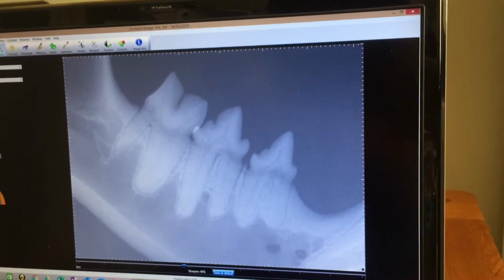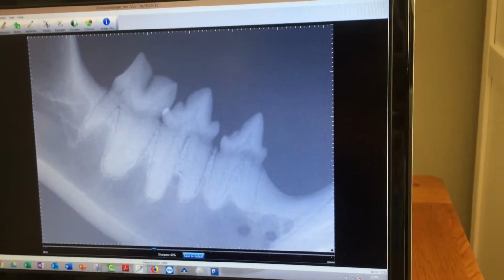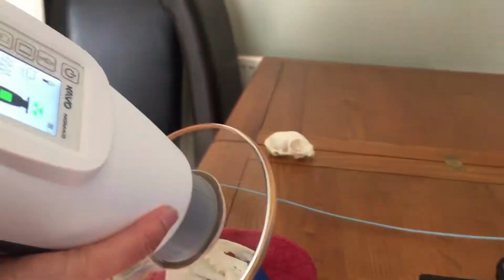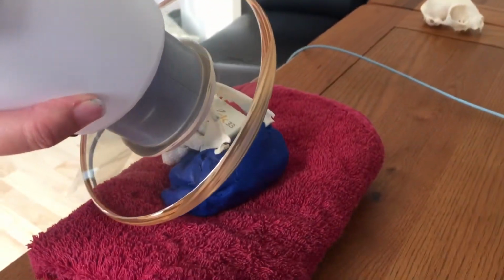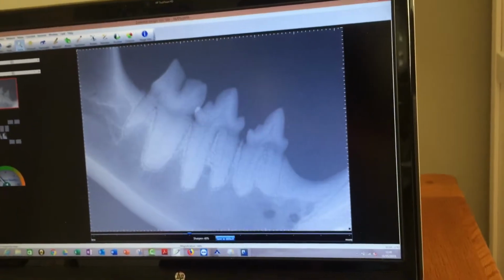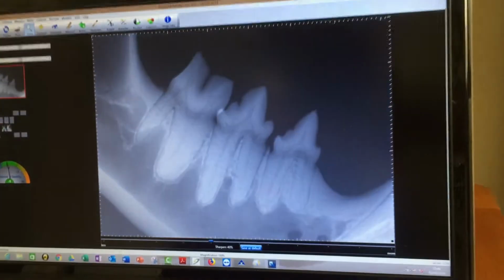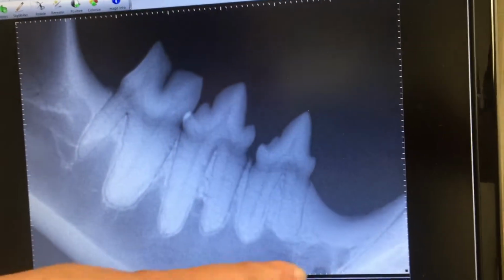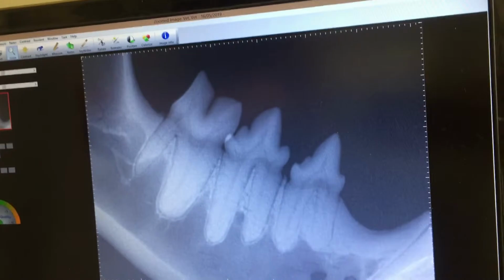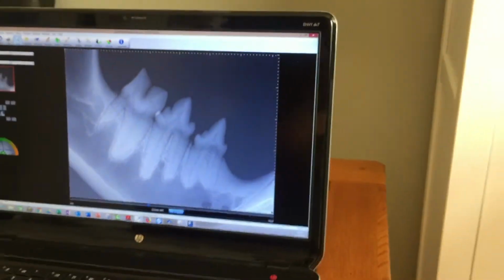Now that was a little bit underexposed because I didn't fire the Nomad correctly, but let's just show you that once more. So we should have a better exposed image this time. There we go. So you see that's the last molar there because this is the border of the canine here, going backwards. So there's the last molar. So that often is a quick and easy way of doing that.